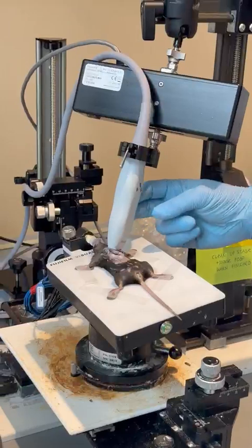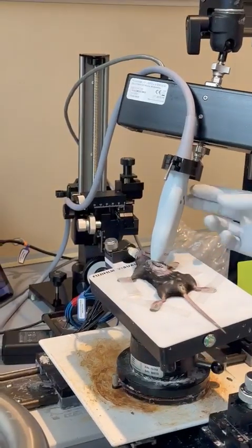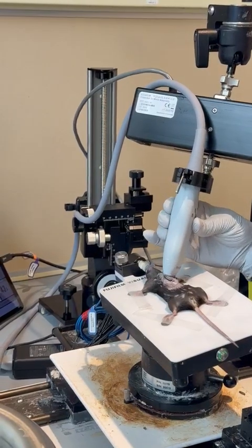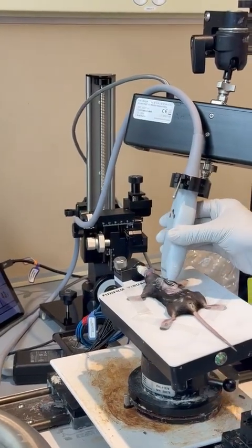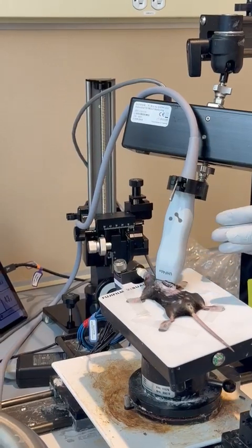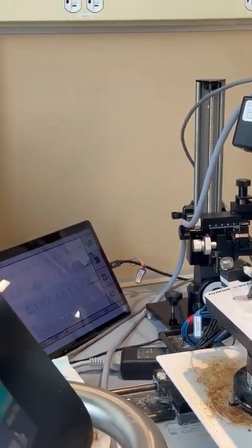I'm gonna see. Just counterclockwise. So just grab here and turn. Oh, manually, okay. And you'll feel it. It's going to be a little bit of resistance to get it going. There you go. And then when you hit that 0 point, you'll feel it. Keep going. You feel it jumped in, locked in there. So there's your short axis image.